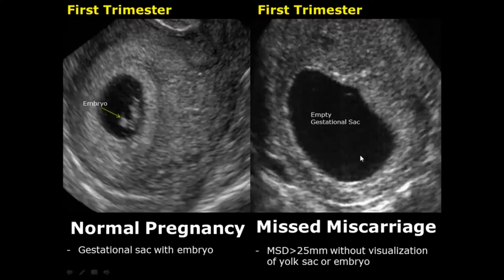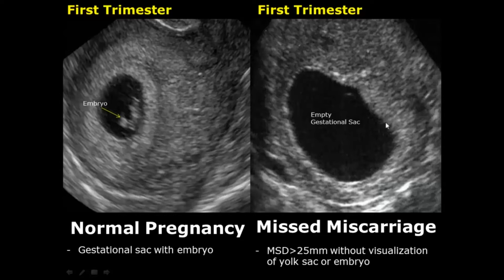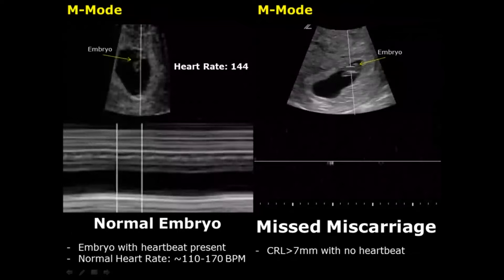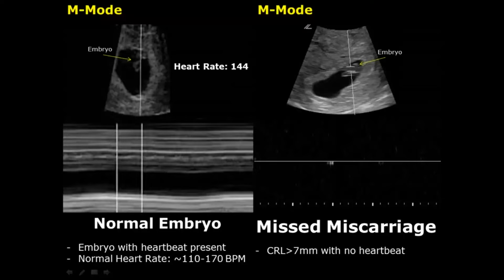A missed miscarriage occurs when there are no clinical symptoms such as vaginal bleeding, but it has some ultrasound features. The first is an empty gestational sac when there is no yolk sac or embryo seen even when the MSD is greater than 25 millimeters. The second feature is a CRL greater than 7 millimeters with no heartbeat — unfortunately in this image there is no heartbeat detected in the embryo.